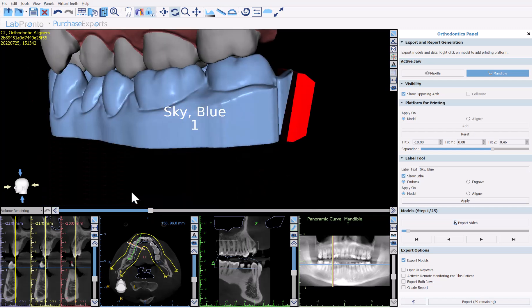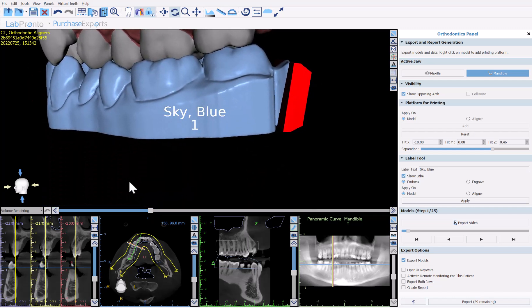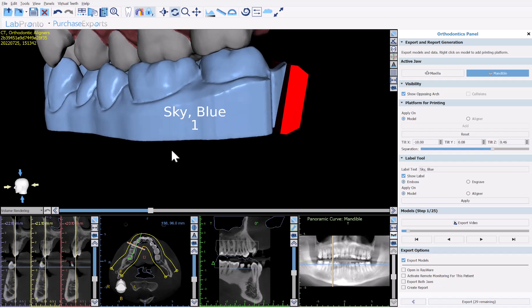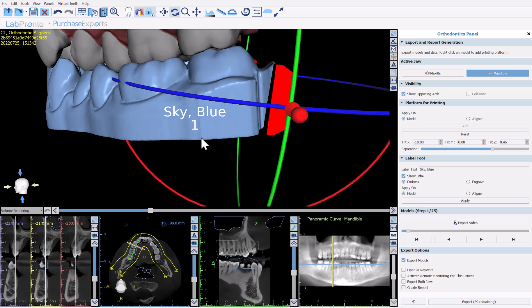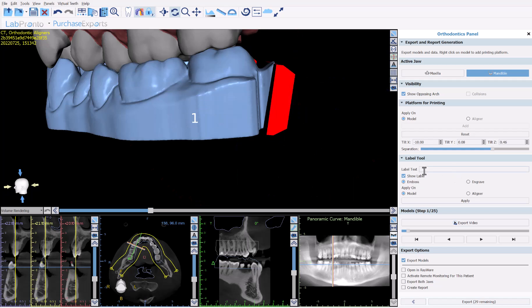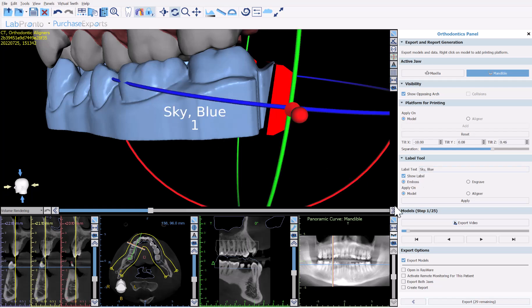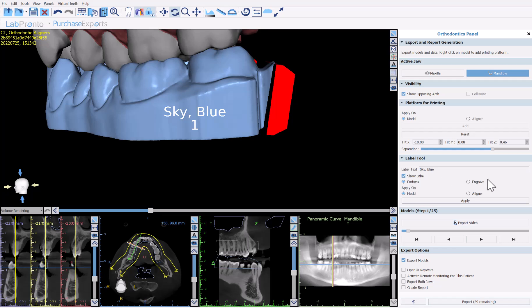Simply enter the relevant text — such as a unique patient identifier — and click show label. You can see the label on screen. Control the label size by zooming the models in and out. Control placement by rotating the models. Place it on the mandible making sure it's not directly on any edge. If you want only the number without any text, remove the text and check show label, and it will show just the number.